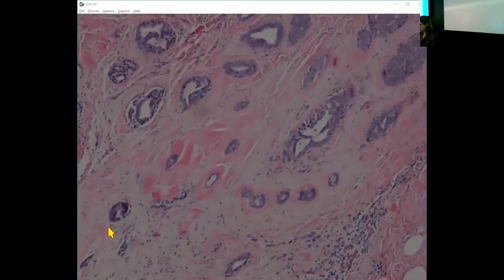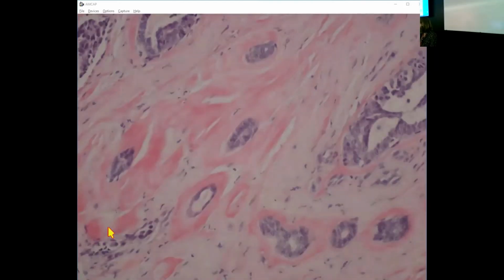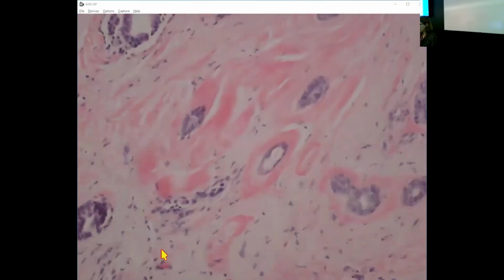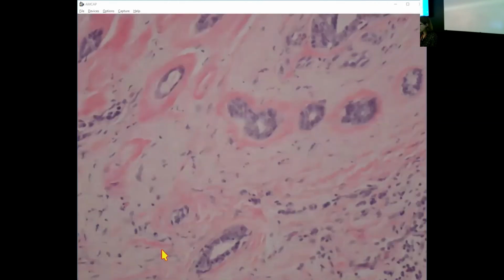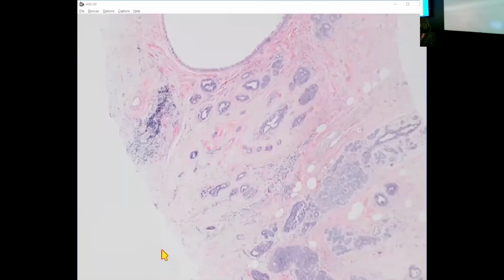And here you can see this change in the stroma. So not to mistake this for a focus of invasive carcinoma, even though it's small, round little glands. They're glands entrapped in the center of the sclerotic core of the radial scar. The slide's a little bit pale, but you can see the myoepithelial cell layer around some of these glands. Frankly, it becomes more attenuated around the ones right in the middle. So that can be challenging, and I'll talk a little bit more about that in my small glandular proliferation slide seminar.